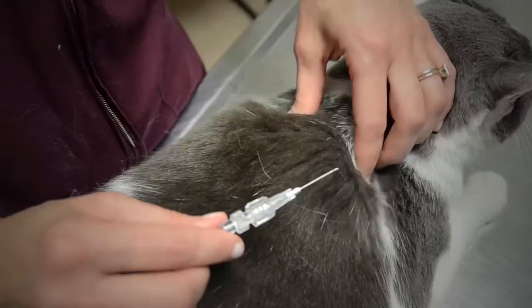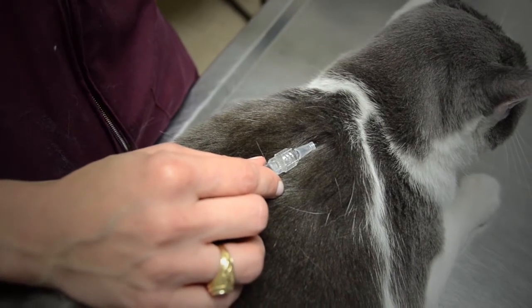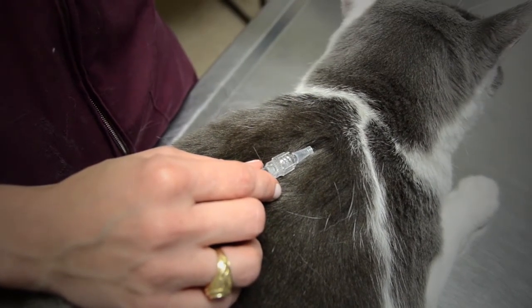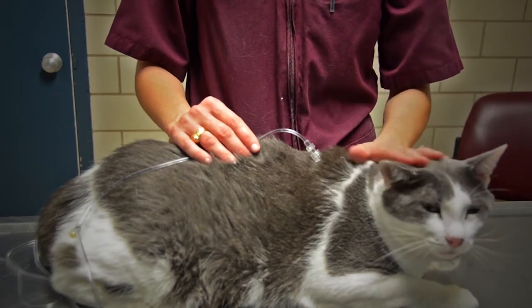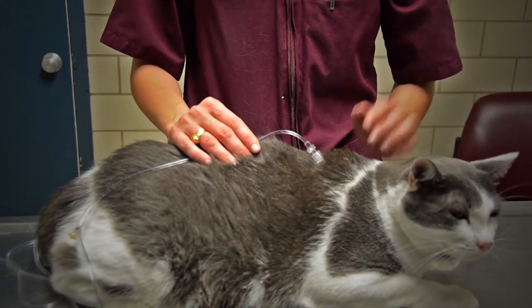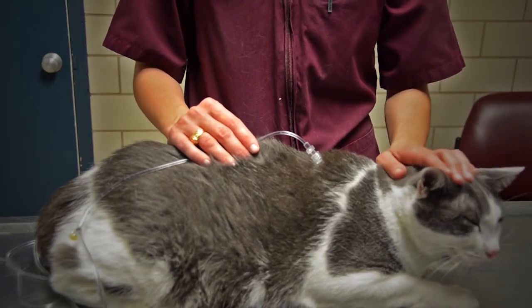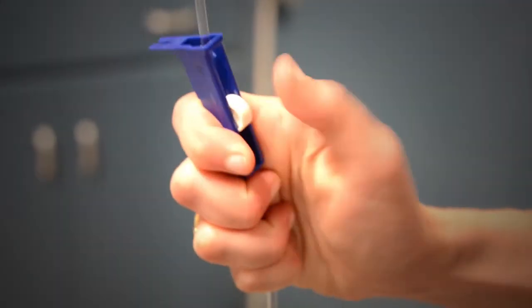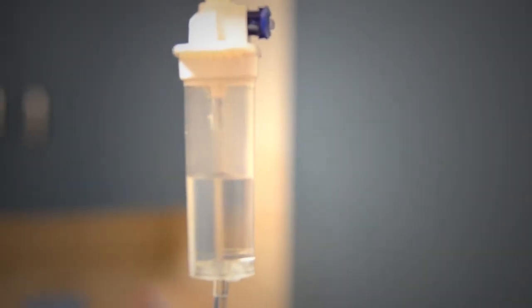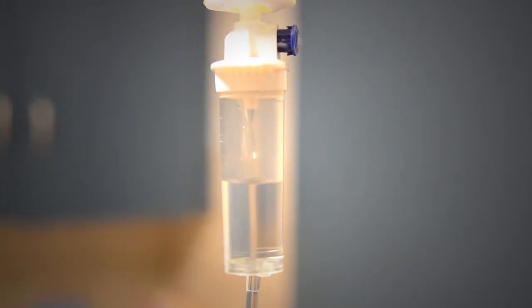I have my brand new needle that I've already changed out. My bevel is up. I pinch and tent his skin. I'm just going to pop that in there very quickly. The faster I go, generally the less it hurts. I'm going to rest my hand on the back of Skippy T, and you see he didn't even jump. As long as you can do this in a confident way, most animals will be okay with this. I'm going to reach over and roll the ball up on my subcu fluids, which will then start the flow of fluids. Gravity is our friend. The higher the bag is, generally speaking, the faster the fluids will flow.